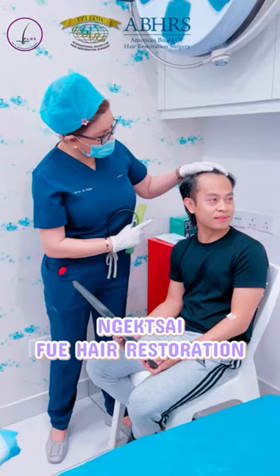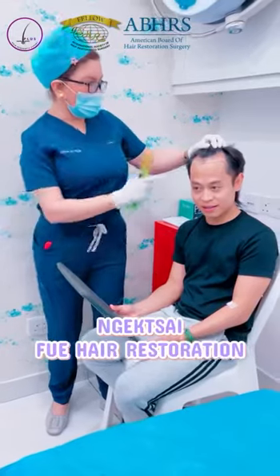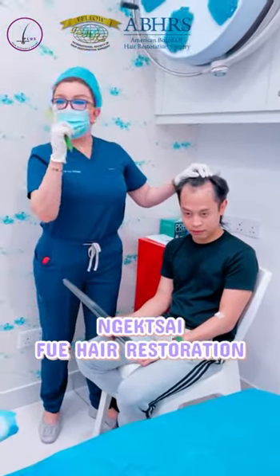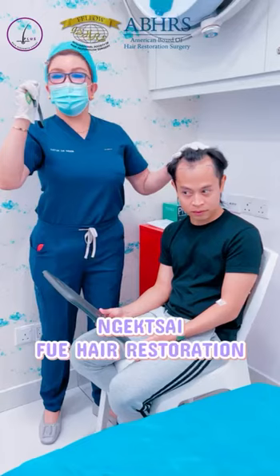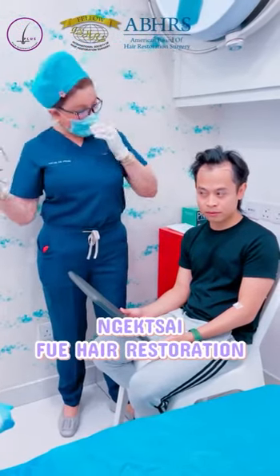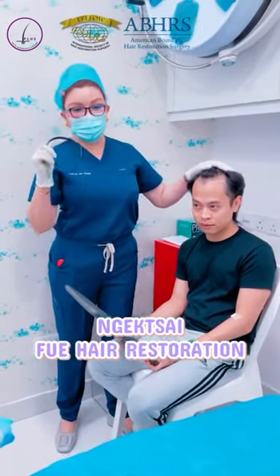You look at it a little bit lower — yes, that's very good. Good to be done today. And then across the first line of the frontal. At the hairline it's all single grafts, and at the temporal points here we're going to take very fine calibre grafts, which we'll sort out later, and transplant them here so it matches with his own hair. Whatever we do, it has to be very natural.